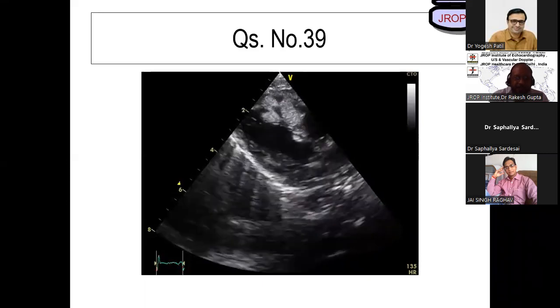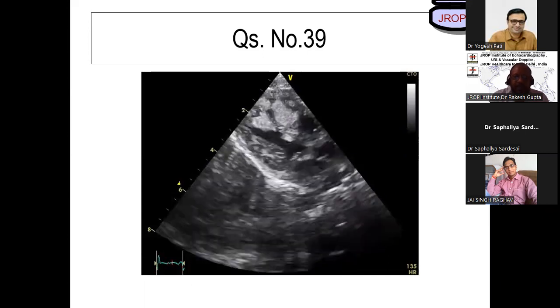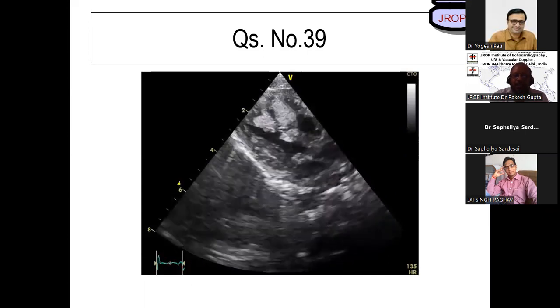A little tough, Jai Singh. You can still try. What do you see in this patient, something normal or abnormal?